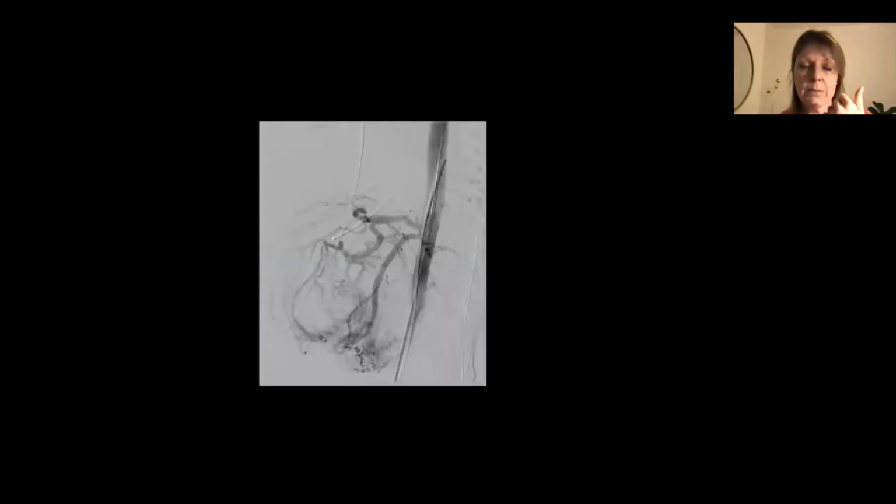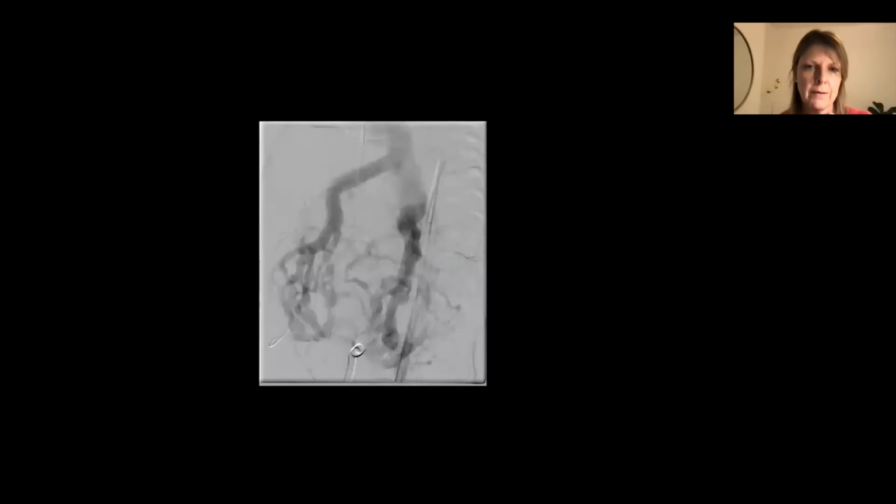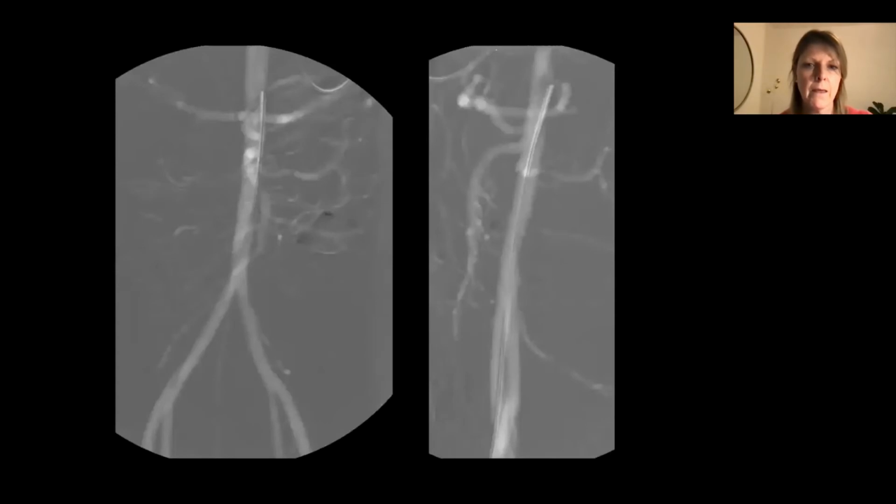We need to think really hard about how much fluid we use, because if we use too much contrast or saline flush for these runs, we're going to further fluid overload this child into further crashing heart failure. But it was really important that we got these angiogram images here. For all of these images here, we have only used about 2.5 mils of contrast for the entire study. And we've got really good imaging of what's going on in this liver and what needs to be done about it.